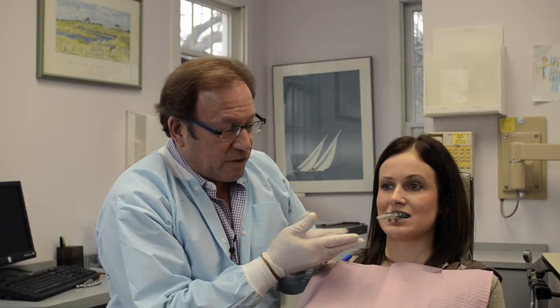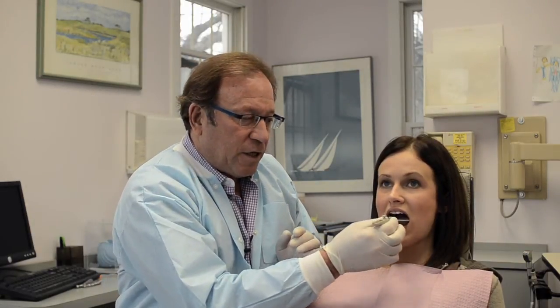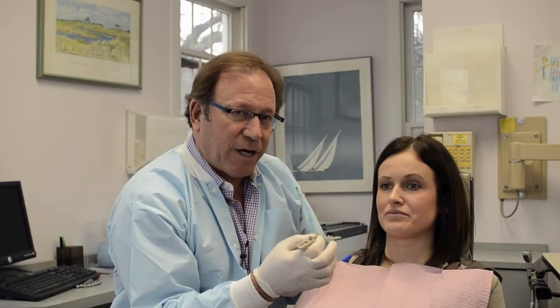Bite down, please, just to see how that feels. And we ask her, does that strain the muscles or the joint? Is that okay? Okay. Now we're going to open, please. We're going to put some wax on this, and then we're going to seat it and get our bite record.